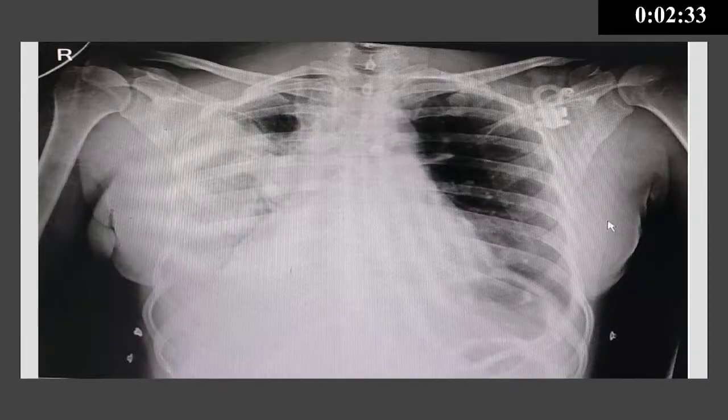So somehow we finished the surgery, and this is her X-ray, immediate post-op X-ray. See the amount of fluid over here, both sides. Around 1200 ml this side, 800 ml this side. Now, why did this happen? Despite me doing the standard surgery at a column height being just above my head, that is 100 centimeters above the waist, no pressure pump.